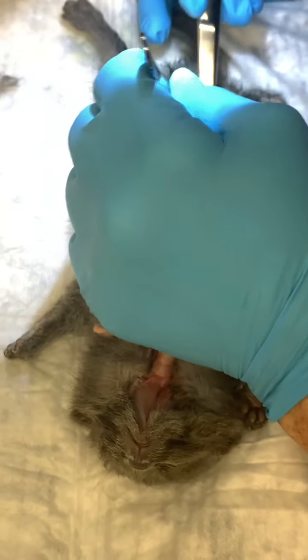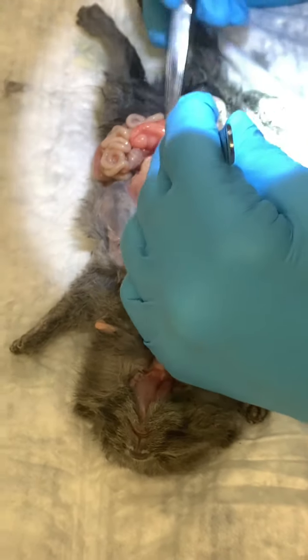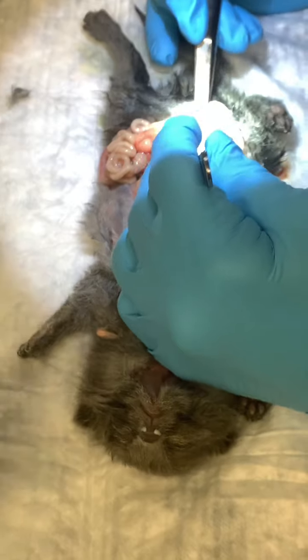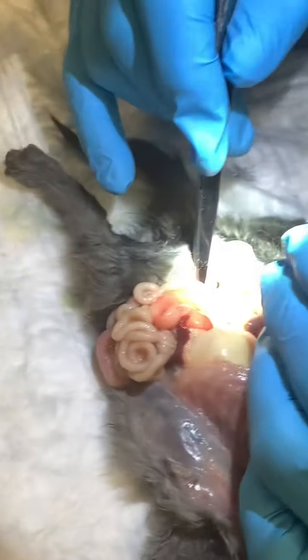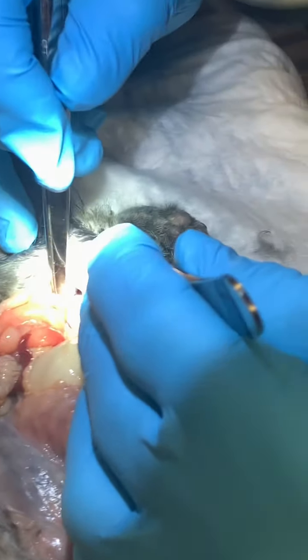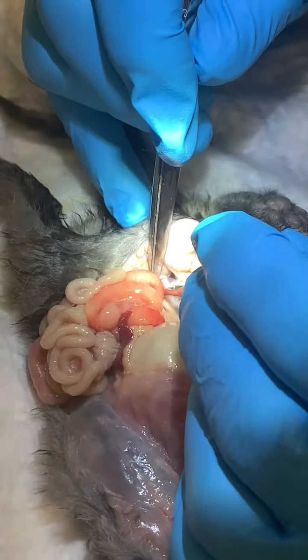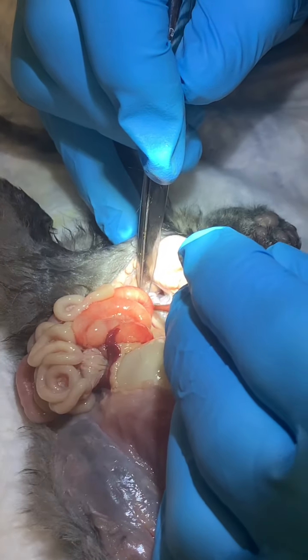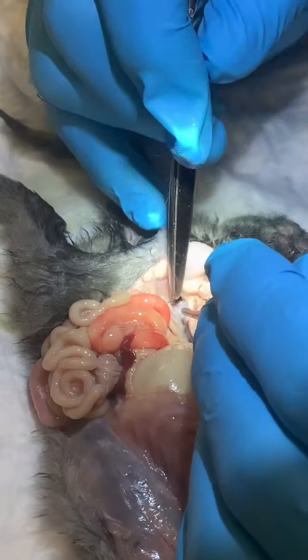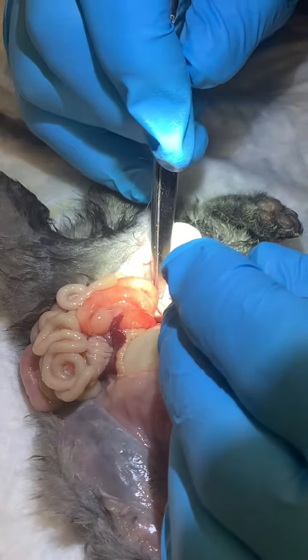So an abnormal left adrenal gland? Yeah. Well, I'm thinking it's abnormal. So then this is where the aorta splits into the femoral arteries. And right there is where male cats get a saddle thrombus that paralyzes them.